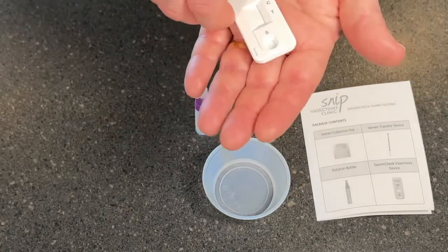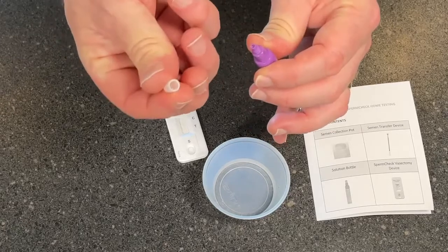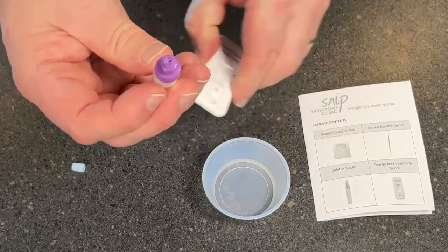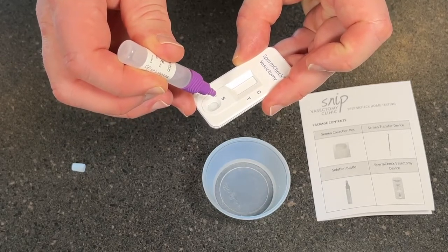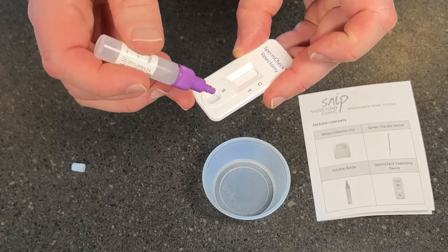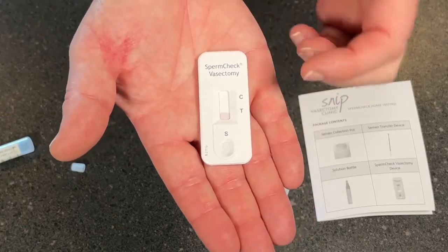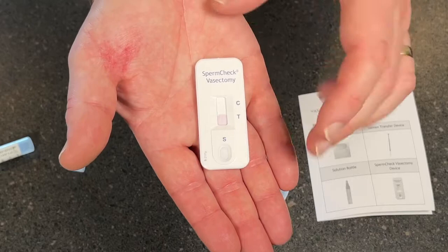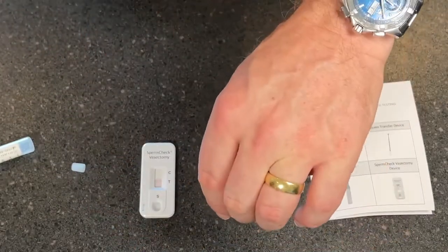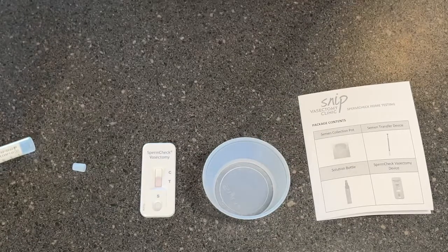Next step: with the bottle that now has the reagent mixed with the semen, take the smaller lid off the top, leaving the purple one on. Turn this upside down and drop five drops into the S well — one, two, three, four, five. There'll be lots of fluid left in there; that's absolutely fine. You'll begin to see the fluid making its way up the window toward the T mark and up to the top. At this point, we're going to wait and count for seven minutes, and we're not going to read the test until seven minutes. At the seven-minute mark, that's when it's accurate. Don't read it after one minute, and don't look at it again two hours later. Wait for the seven minutes, then come back and look at the test.